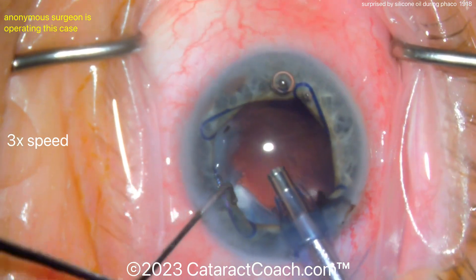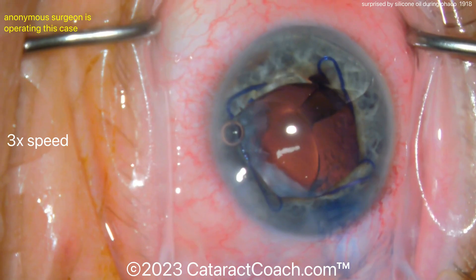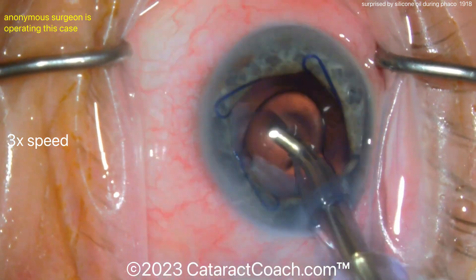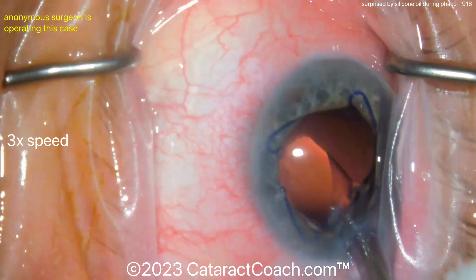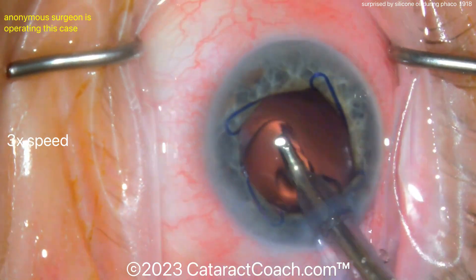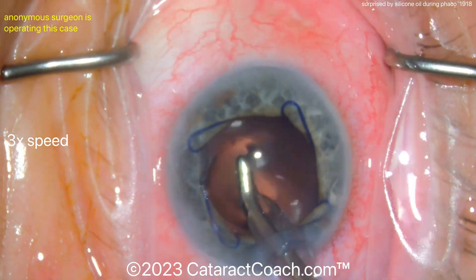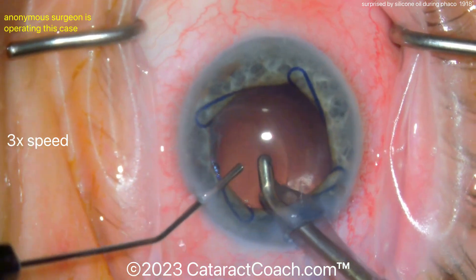The goal here is to clean up that cortex, whatever you can in the capsulorhexis bag. You're going to get a lot of silicone oil coming out of this eye. The retina surgeon placed silicone oil inside the vitreous cavity at the time of vitrectomy, and that's when the posterior capsule was nicked. As you go in with cortex removal with the IA probe, you'll get prolapse of more and more silicone oil. You can float out most of the silicone oil by putting a trocar in the eye — either pars plana, or even a 23-gauge plastic IV catheter through the main incision, through the posterior capsule — and by slowly infusing BSS into the vitreous cavity. BSS is heavier than silicone oil, so it'll go down toward the macula while floating the silicone oil up, and you can keep burping the silicone oil out through the main phaco incision. It's tough to aspirate silicone oil through the tiny aspiration port of the IA probe, so in essence you're just washing it out of the eye.